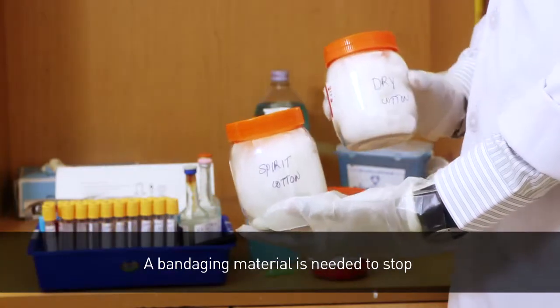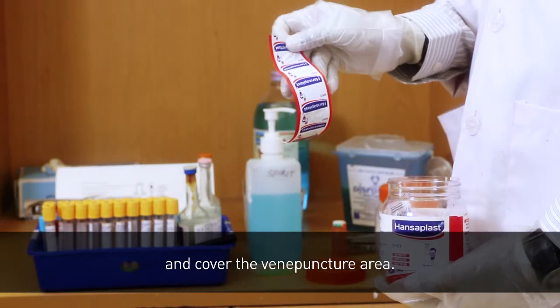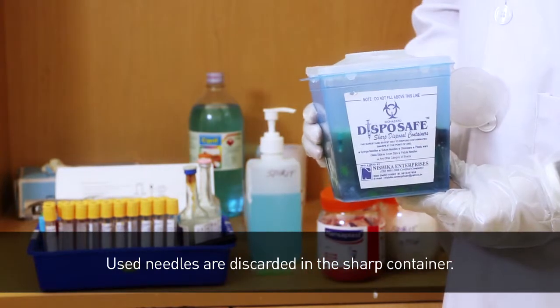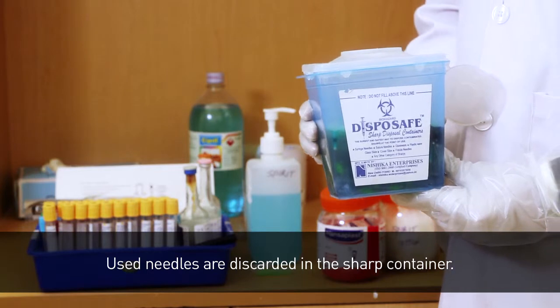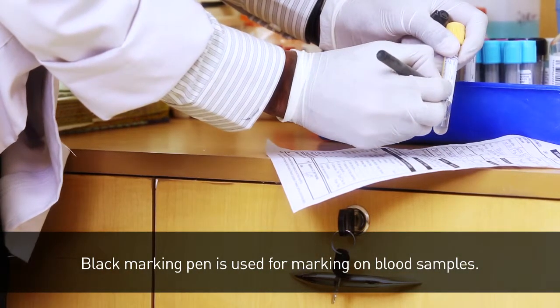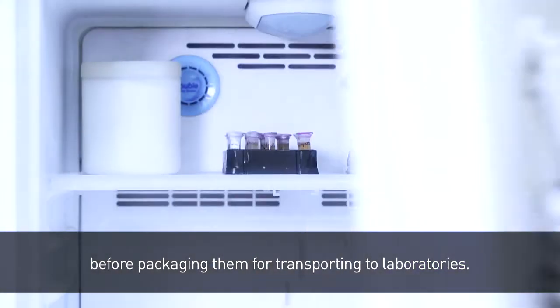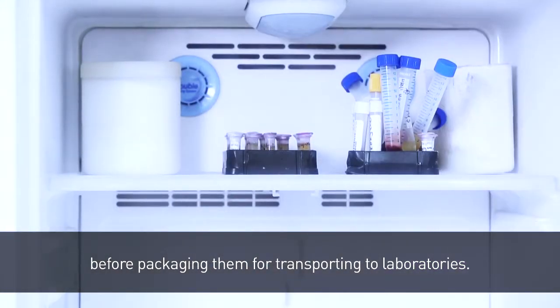A bandaging material is needed to stop blood and cover the venipuncture area. Used needles are discarded in the sharps container. A black marking pen is used for marking on blood samples. After collecting the blood samples, they are stored in refrigerators before packaging them for transporting to laboratories.